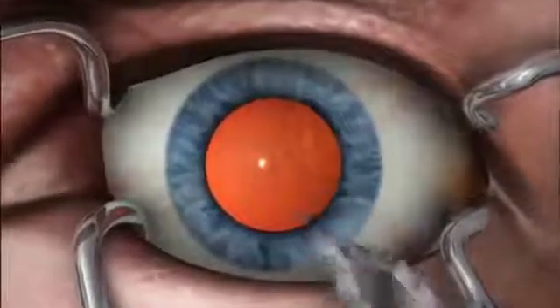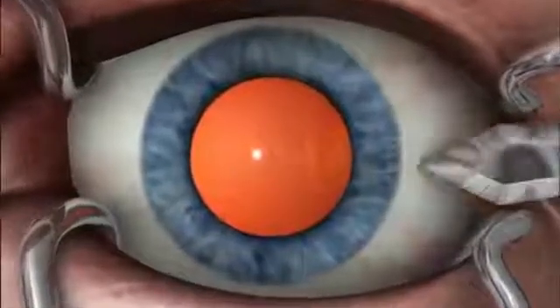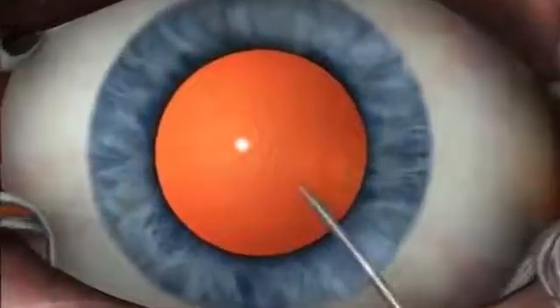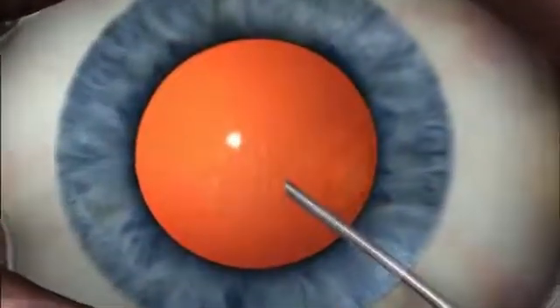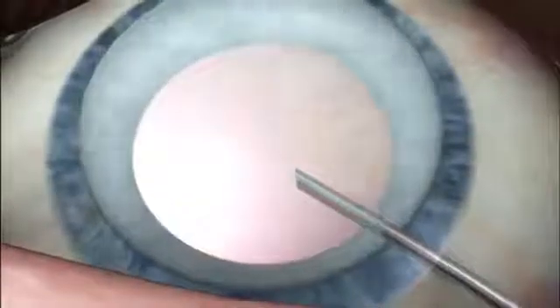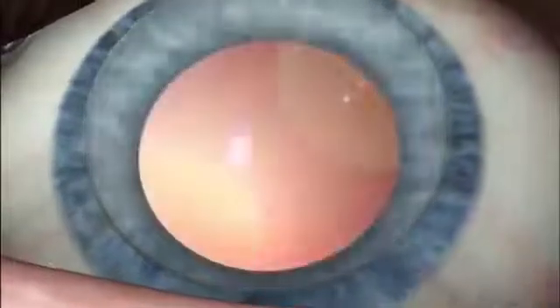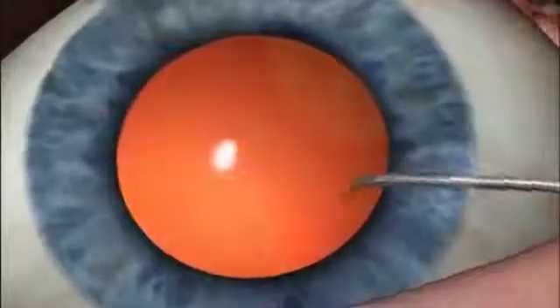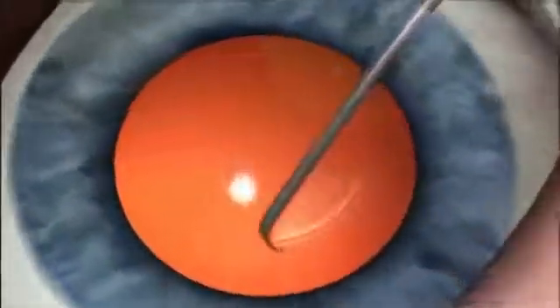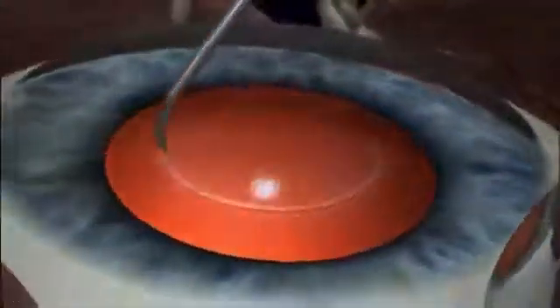Then a small incision is made in the cornea of the eye. Fluids are injected into this incision to support the surrounding structures. The top of the lens capsule is then removed to gain access to the cataract.